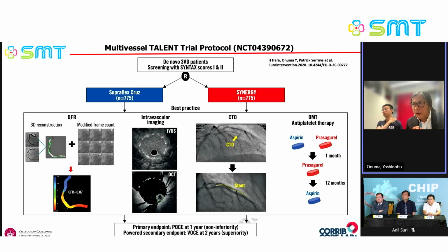The clinical site sends the angiography to the core lab, we analyze the QFR and get back to the site and indicate which region is to be treated according to QFR. We did the SYNTAX II trial before the Multi-Vessel TALENT. At that time, we used the iFR to guide the planning of the procedure, but in this trial we now use QFR, the angio-based FFR simulation.